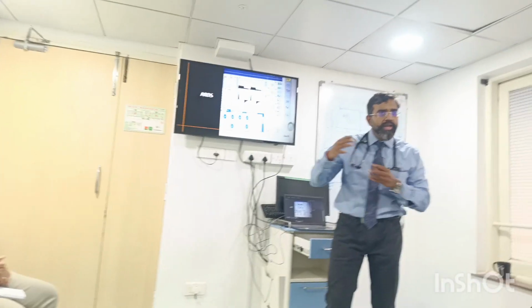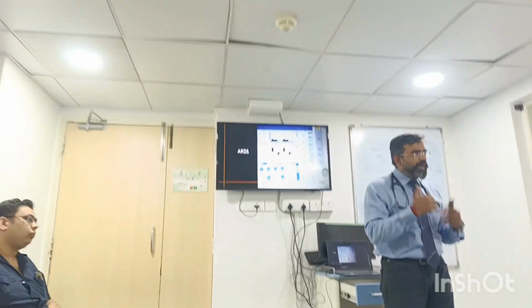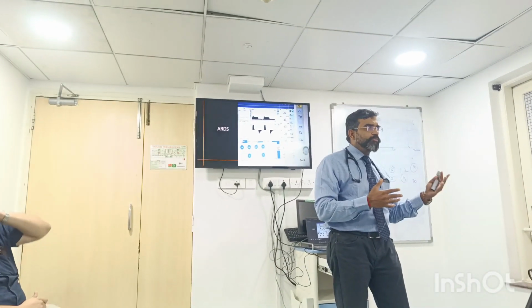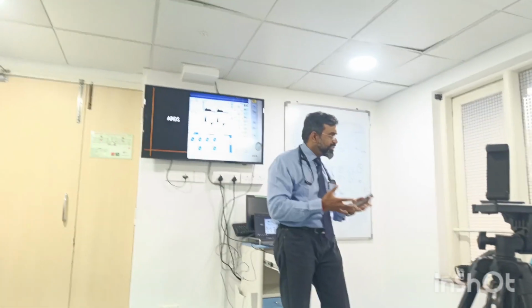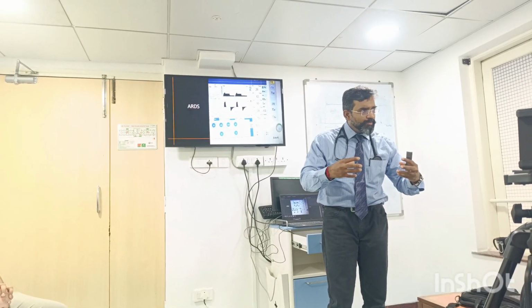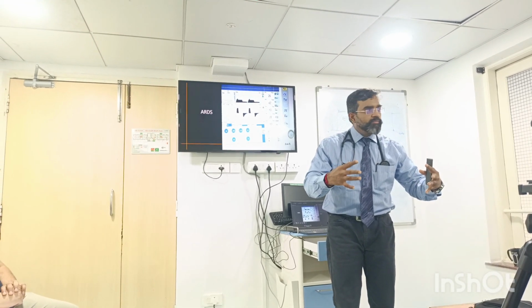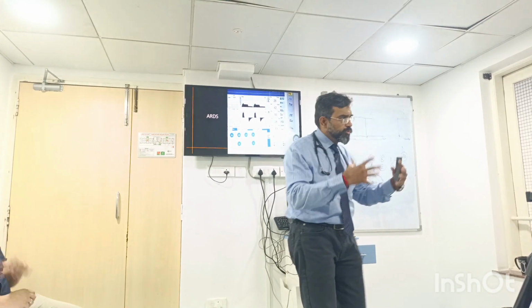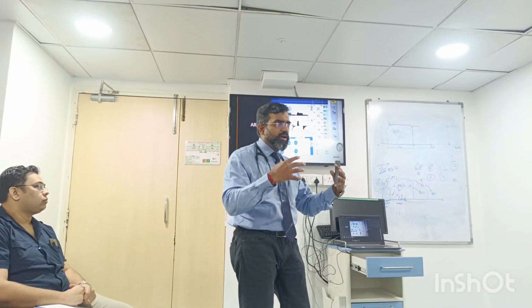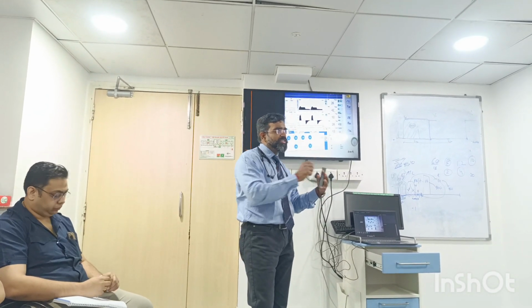You have started looking at what is happening inside the lungs, because later on, as time goes, you want to come back and see, okay, what has happened to my compliance? What has happened to my oxygenation? What has happened to my plateau pressures? That is what you're going to come and see, isn't it? Because as time goes, those areas that were collapsed are slowly going to open up. When they open up, the compliance is going to change. When my compliance changes, my tidal volumes need to change, my plateau pressures are coming lower, I can make it more comfortable for the patient, I can keep it less injurious, and accordingly change parameters.